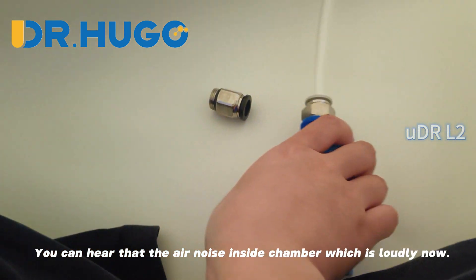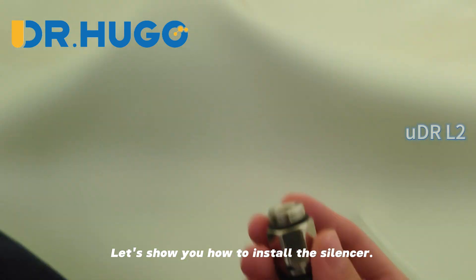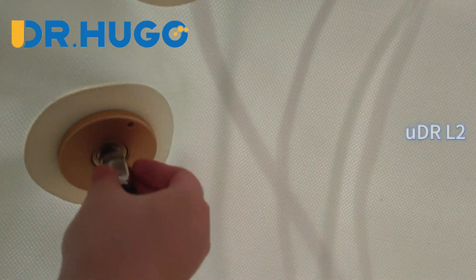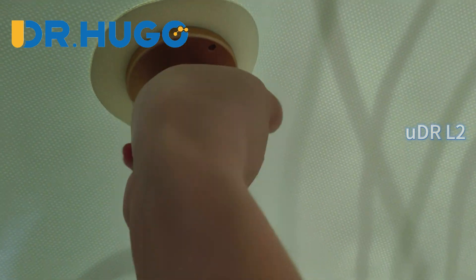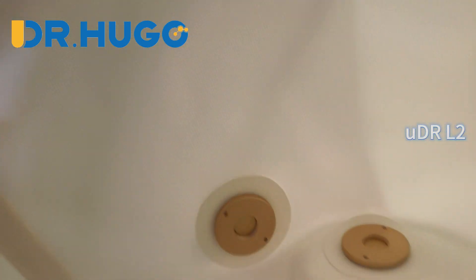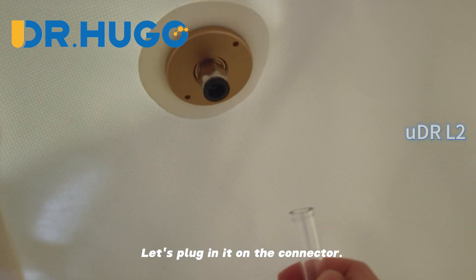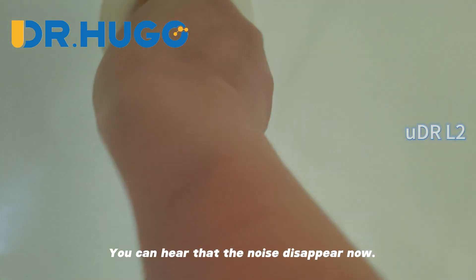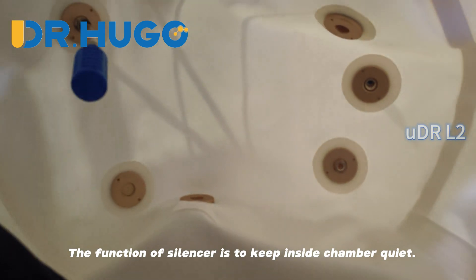You can hear the air noise inside the chamber. Let's show you how to install the silencer. Install the silencer connector first. This is what the silencer looks like — let's plug it into the connector. You can hear that the noise disappears now. The function of the silencer is to keep the inside of the chamber quiet.